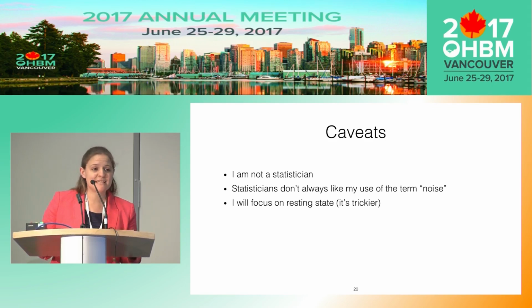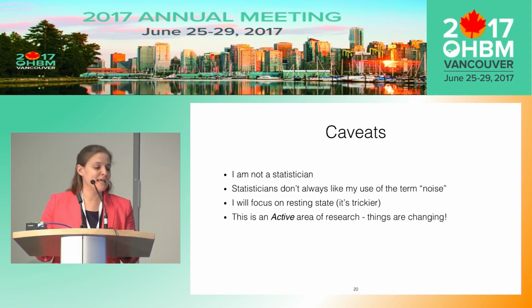I'm going to focus on resting state because it's trickier. Denoising and nuisance regression is the critical thing in defining what signal is. A lot of what I'm saying will hold for task-based. But this is a very active area of research. Things are changing. When you're setting up denoising and picking nuisance regressors for your study, look at the latest and greatest literature because this is an active field.